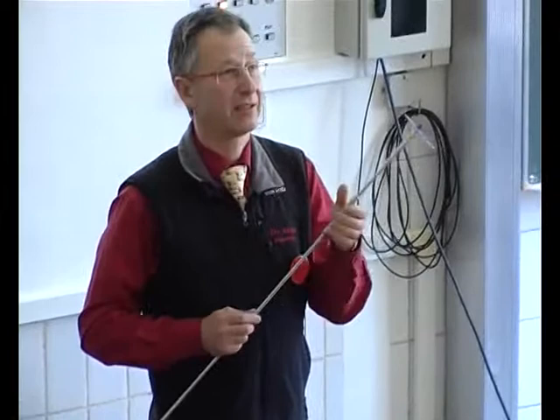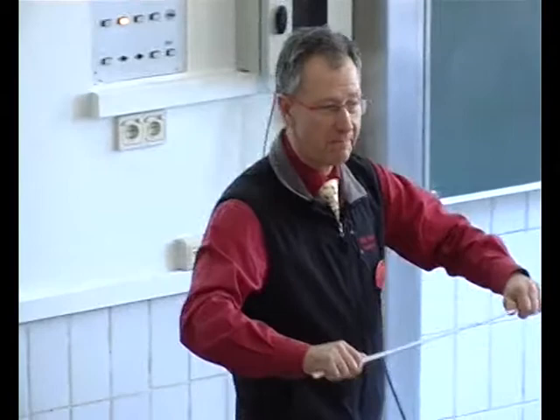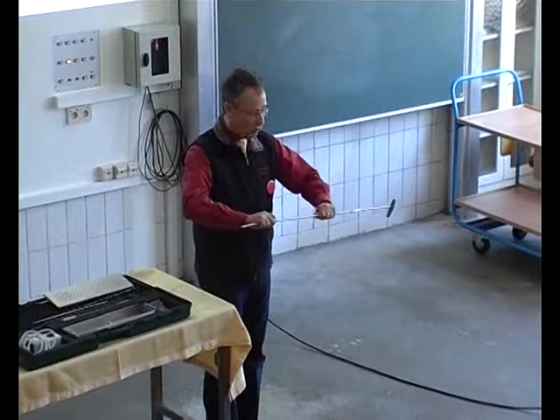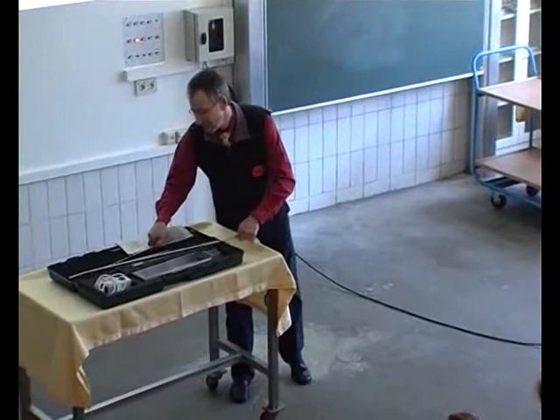It's the tough one, because most of the surgeons like it in a tough way. But with time, you should be aware that you can bend this as you like. It's no problem, and the tube is tough enough, and you can rebend it as well. So you can shape it as you like. It consists of 4 parts.